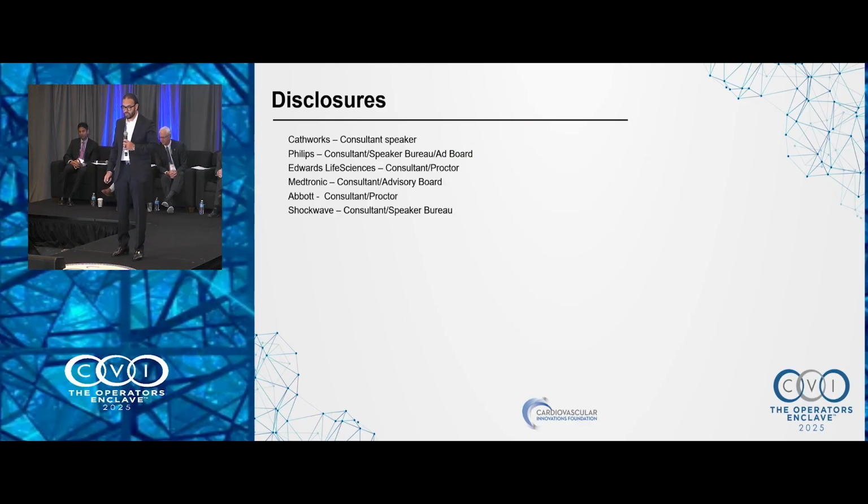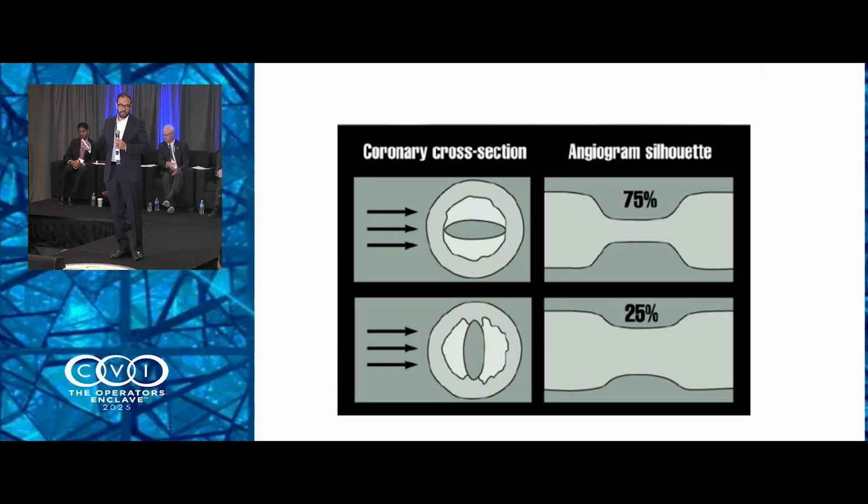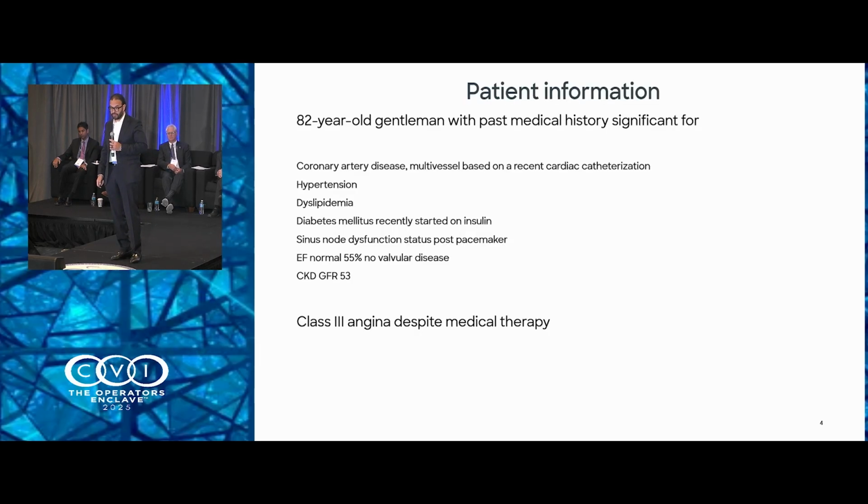So obviously, within the session on physiology, we understand that angiography has a lot of limitations, and that's why we had to think about other technologies, other modalities to assess pressure loss within a vessel. We've been talking about wire-based physiology, which requires measuring pressure across lesions and in a vessel. That's because one view may look narrow, the other view may not look so narrow, and that has always been the dilemma of angiography.